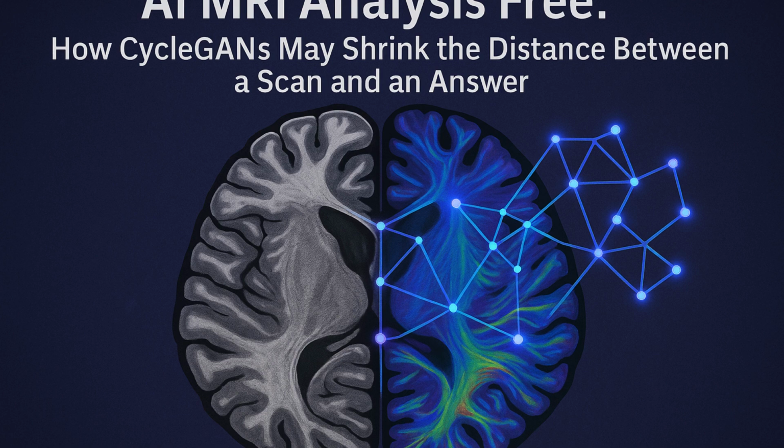But, as the preprint notes, there are still things to keep in mind. Always. It's a volumetric model, 3D, which is more complex. True, more data to handle. Trained on unpaired data, which is efficient, like we said, but needs careful checking. Absolutely. Validation is key with unpaired training. And the fact it seemed to work okay even on brains with big problems like glioblastomas, that was surprising, right? But good. Very notable, yes. Robustness on pathological brains is a big plus. Often AI models trained on normal data can stumble when they see disease.